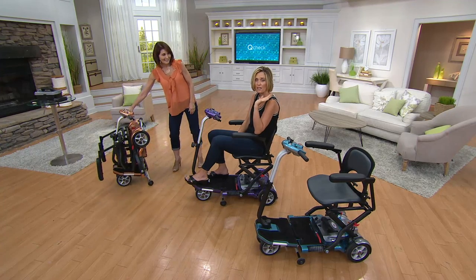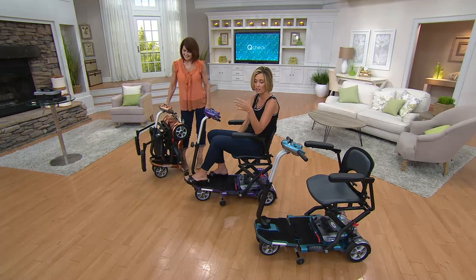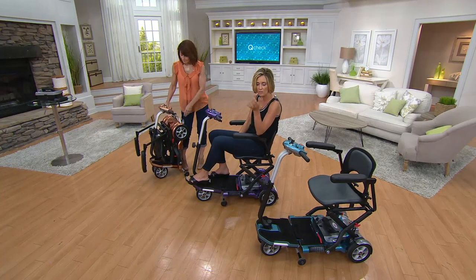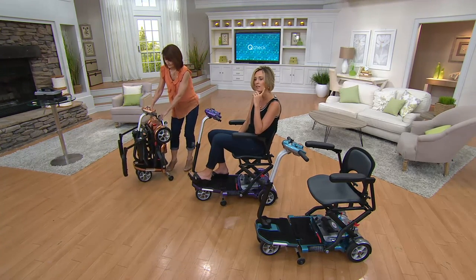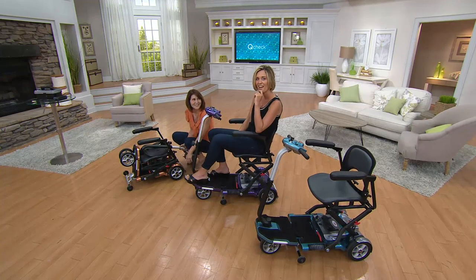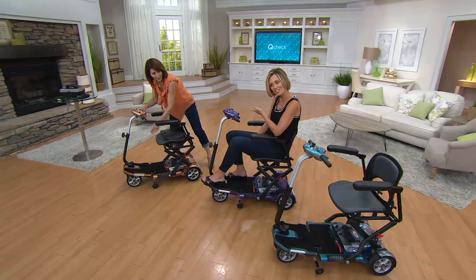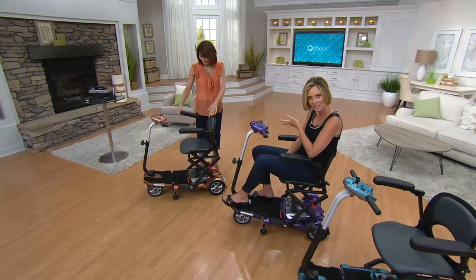It used to be if you got something similar to this, first of all it wasn't as good looking, and second of all you had to have a garage for it. This you can actually store somewhere. Let me tell you about our colors — one of the things I love about Denise is that she always matches her product. She's wearing her copper shirt today because she's showing the copper EV Rider.